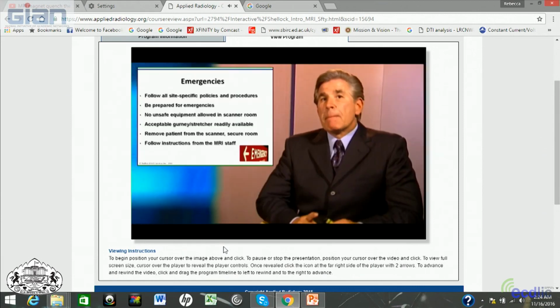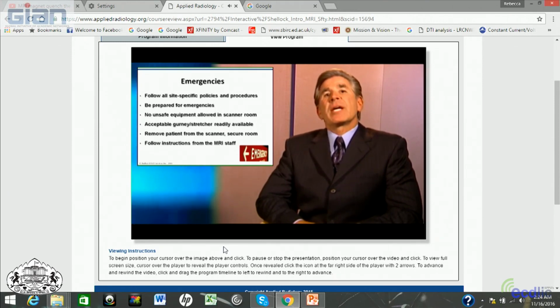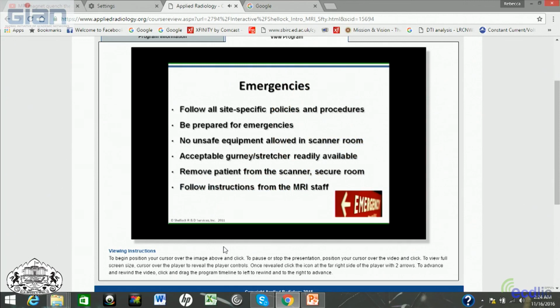MRI facilities must develop and regularly practice an emergency plan that explains the critical activities for staff members, defines the use of special equipment, and that addresses other pertinent issues related to medical or other emergencies in order to ensure MRI safety. It is especially important for the patient to be removed from the scanner room prior to the arrival of an emergency response team, so the MRI facility must have a carefully planned and rehearsed procedure in place to accomplish this task.